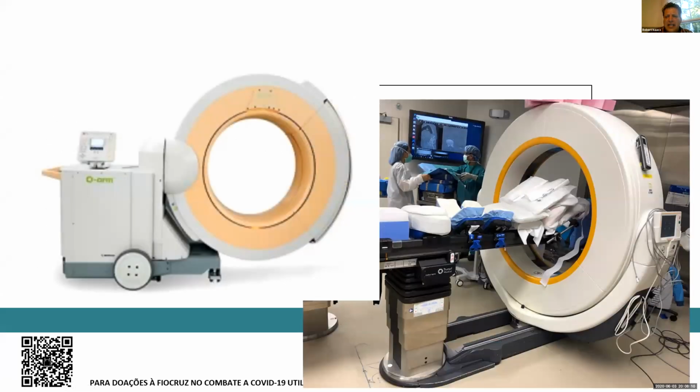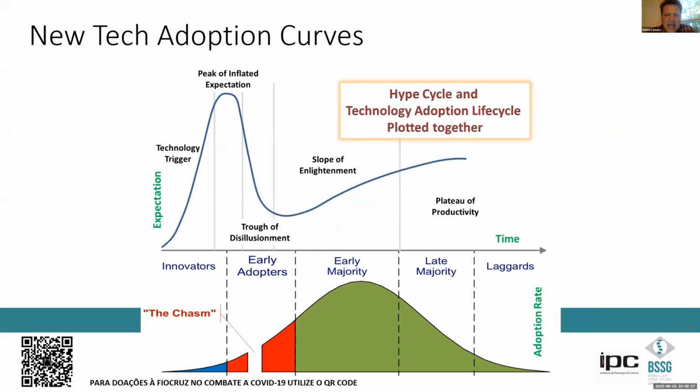And you also see a rise in the amount of intraoperative CAT scanning devices like the O-arm and the Aero. These devices, plus obviously getting preoperative scans, become critical to the advent of the acceptance of these technologies. But when you look at new technology, you'll see that the technology adoption curves tend to follow a certain trend.